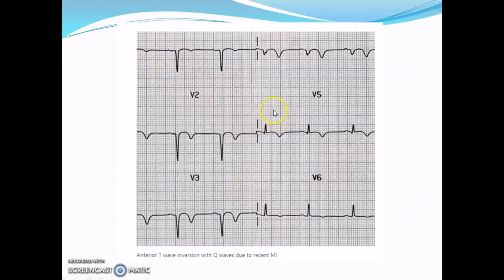See, this is a case of ECG showing a recent MI. You see this T wave inversion. See, this limb and this limb are symmetrical. That is symmetrical, like a V. Asymmetrical means one limb will be like this and the other limb will be smaller. So the two limbs will not be symmetrical. So this is one limb, this is the second limb of the T wave.